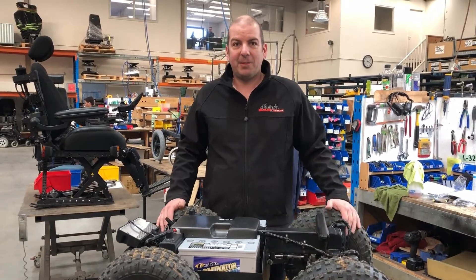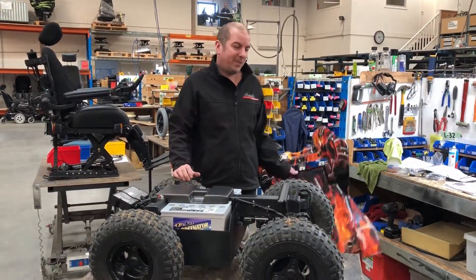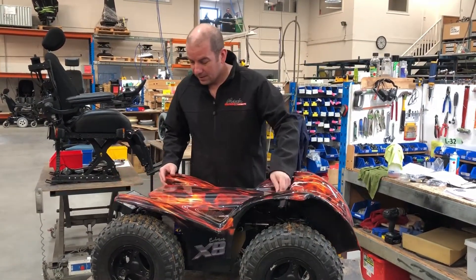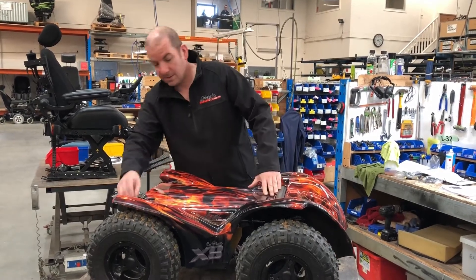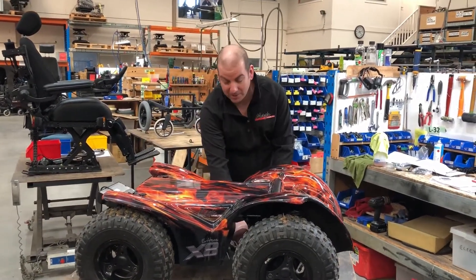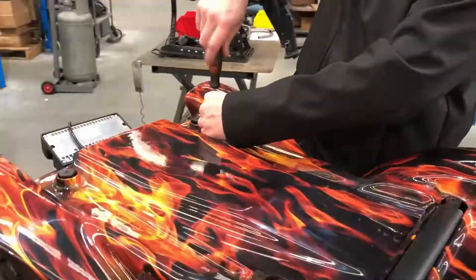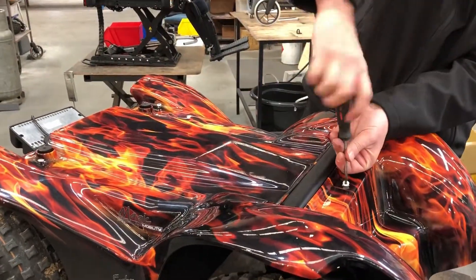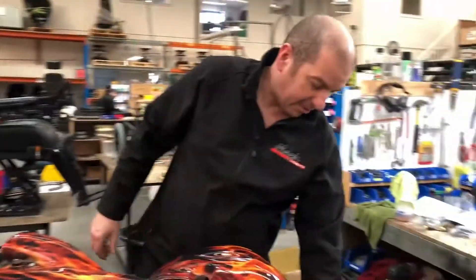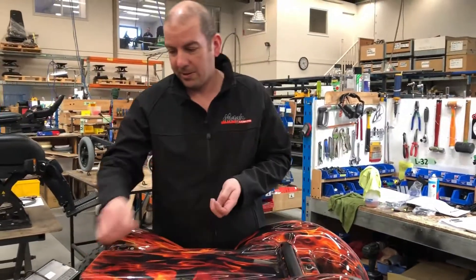Now our batteries are back in and the cover's on, we refit our tray, lining up the three screw holes and replacing the screws we took out earlier. Then we refit the three plastic caps, and we're good for the seat unit to go back onto the chair.